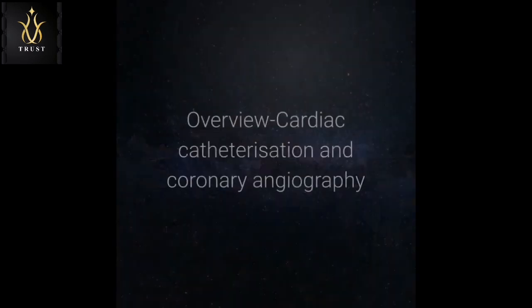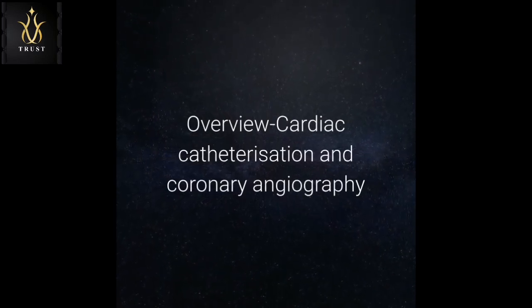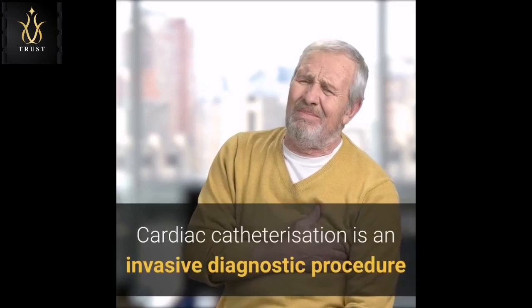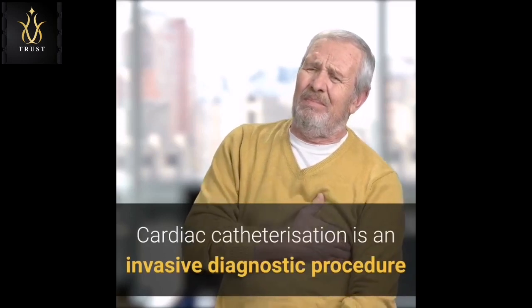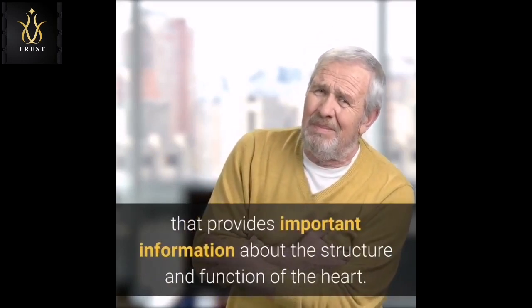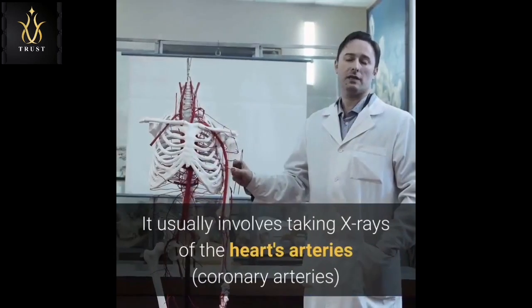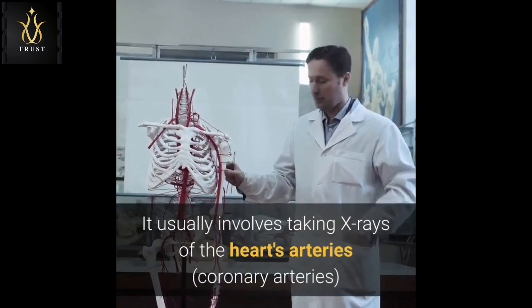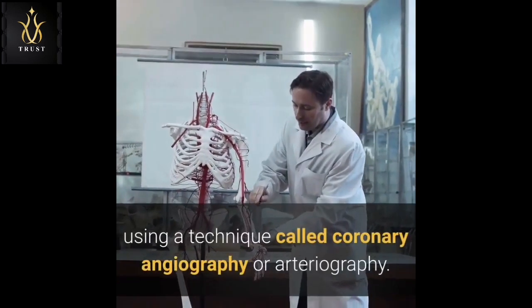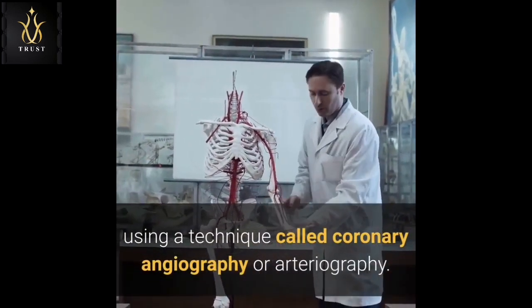Overview: cardiac catheterization and coronary angiography. Cardiac catheterization is an invasive diagnostic procedure that provides important information about the structure and function of the heart. It usually involves taking x-rays of the heart's arteries — the coronary arteries — using a technique called coronary angiography or arteriography.